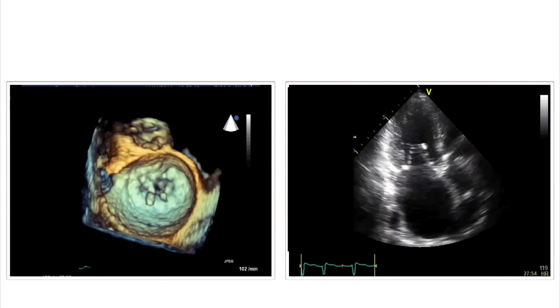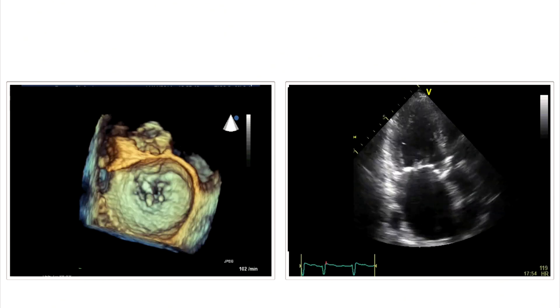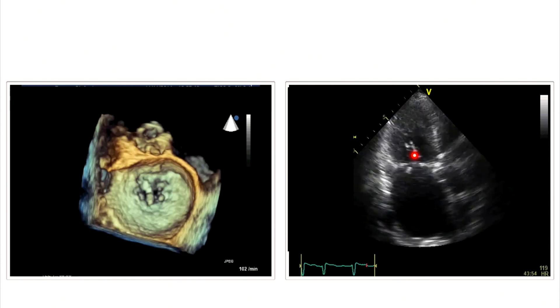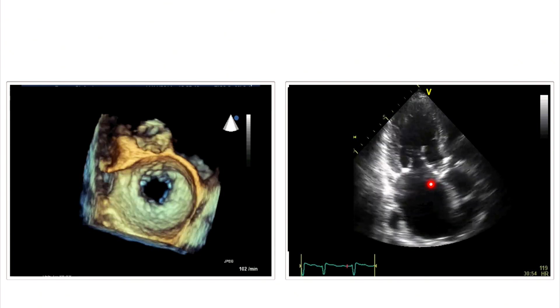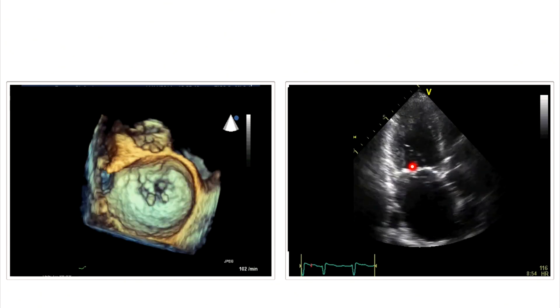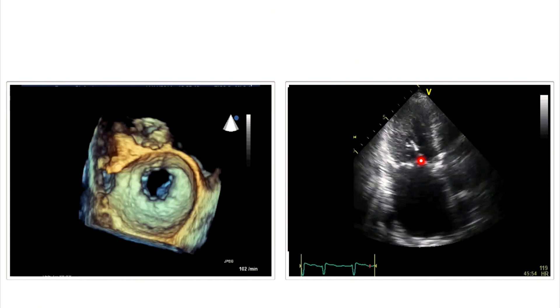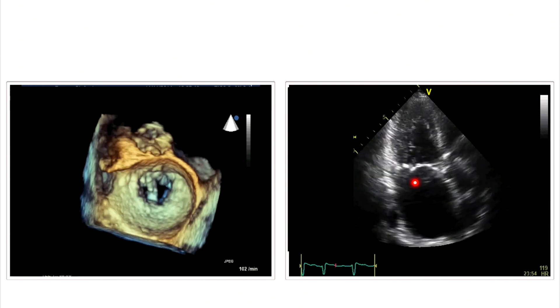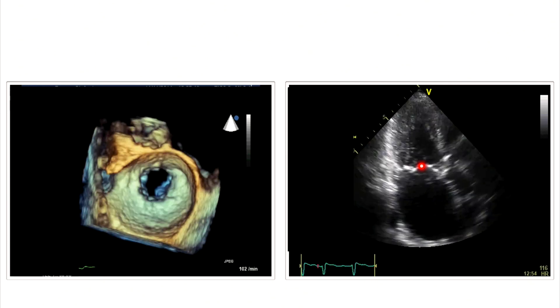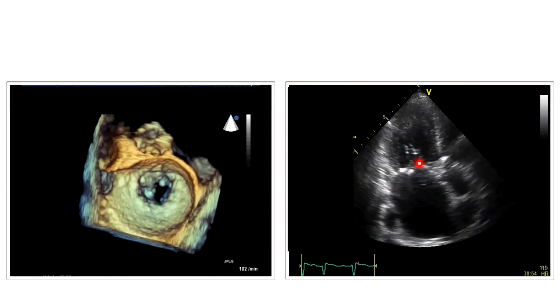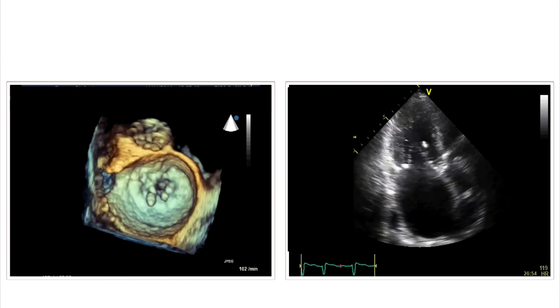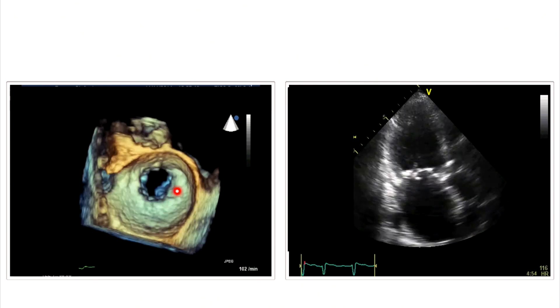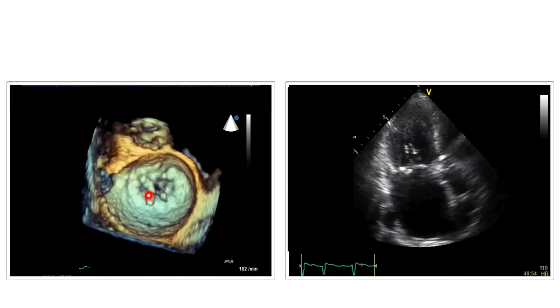What about this patient here? Here we have a 2D image as a reference. The patient also had endocarditis at some point, and this is probably a torn cordial structure or maybe even the remnants of a vegetation. Here is the structure again in 3D echocardiography, and we see that there are actually two such structures on the mitral valve.